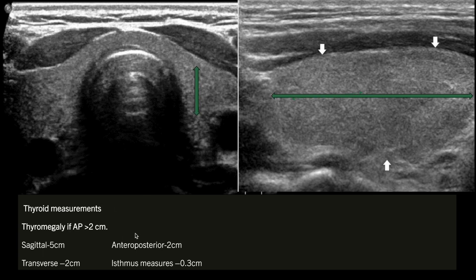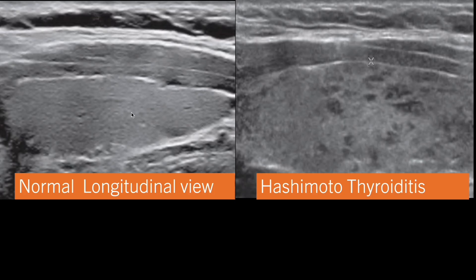The anterior-posterior measurement is the most important — if it is more than two centimeters, we call it thyromegaly. The other measurement is transverse. So generally we take three measurements and among them the anterior-posterior measurement is quite important. The isthmus can also be measured, and normally the isthmus thickness is around 0.3 centimeters.